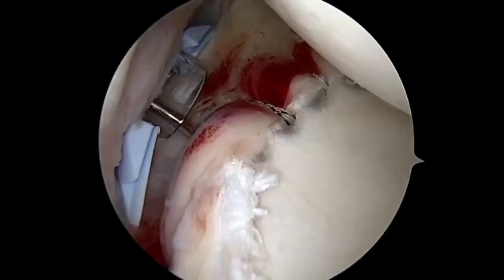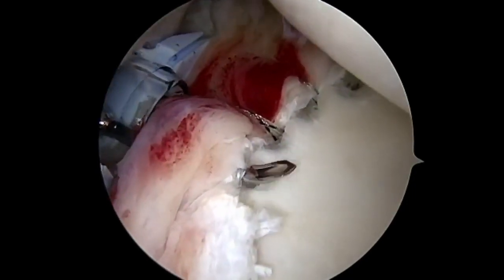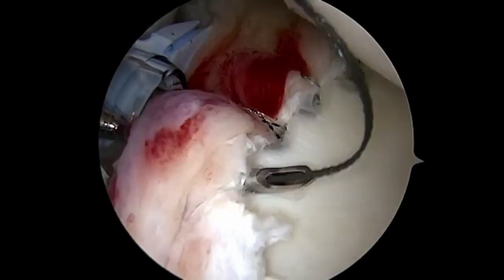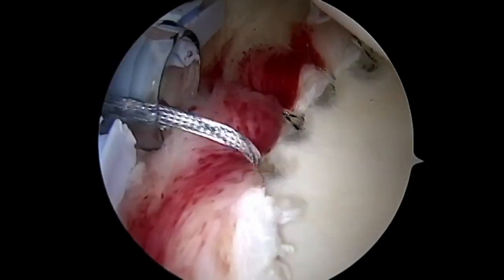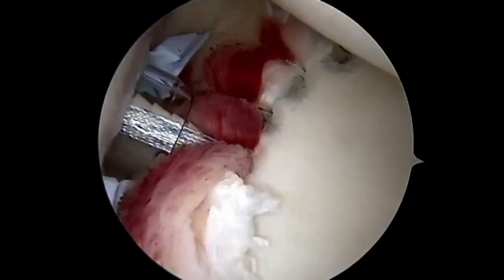One tip when using the suture passer: we'll go through capsule, aim towards the labrum. Typically, I'll hit the glenoid bone and walk it up until I hit the transition to the labrum, and then sneak the wire underneath the labrum. As you can see, multiple anchors can be placed quickly and efficiently using this two-portal technique.